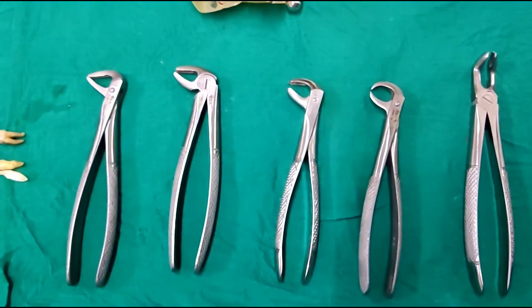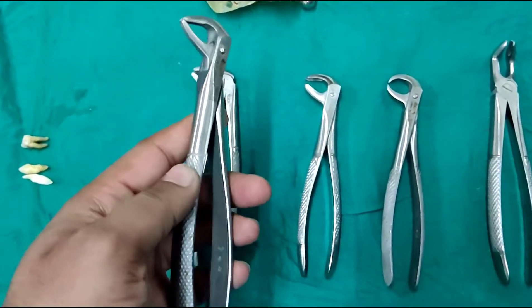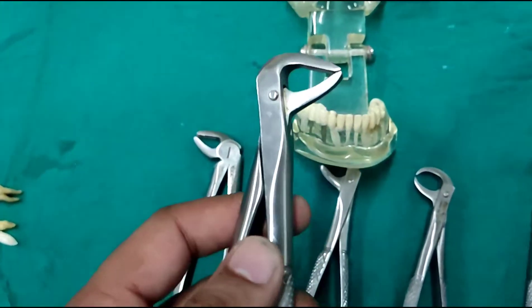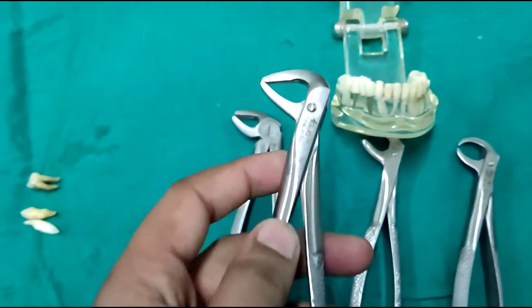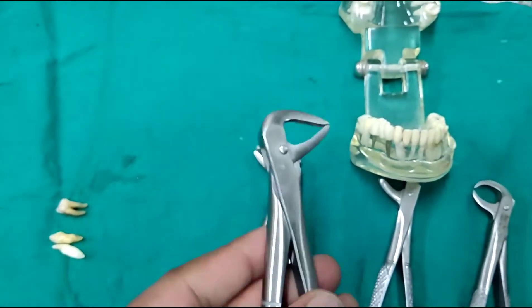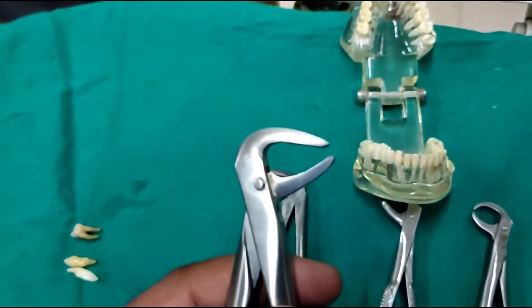Now let us look at the types of mandibular forceps. The first one is the anterior forceps, or incisor forceps, used to extract the anterior teeth or incisors. To identify a mandibular anterior forcep, the beak is the differentiating factor — the handle is the same in all. The beak of the anterior forcep is narrow and thin, with no spacing between the tip of the beak. This is because the mandibular incisors are very thin and narrow, so we need a narrow beak to engage the tooth and transfer forces.